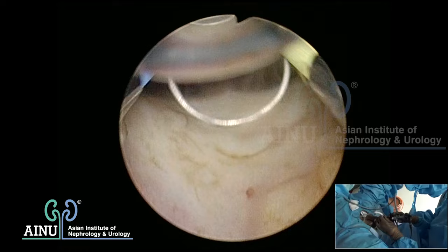Some chips are blocking my view. The tissue is between here and here - this last one-third of the prostate I am going to resect now. The proximal two-thirds and distal portions are at the same level of resection. The idea is not to reach the capsule at every point immediately - first create a good cavity. As a beginner, don't worry about the capsule initially; create a good cavity first, then reach the capsule at all places at the end.